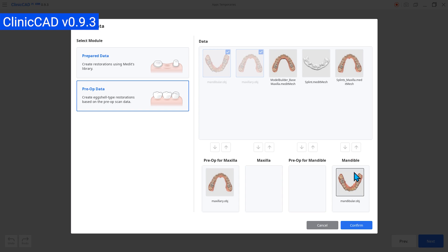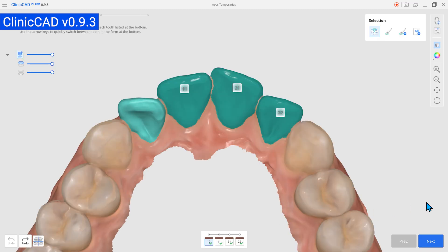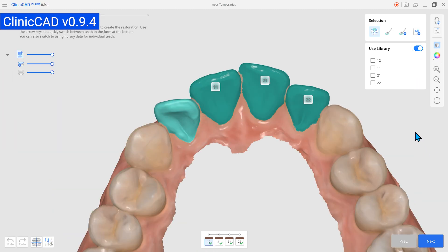Let's now have a look at the improvements from the update. You can use library data when designing eggshell-type crowns. You no longer need pre-op data to create eggshell crowns.